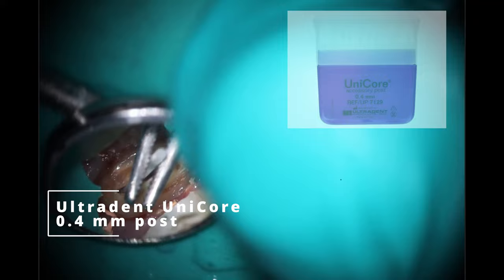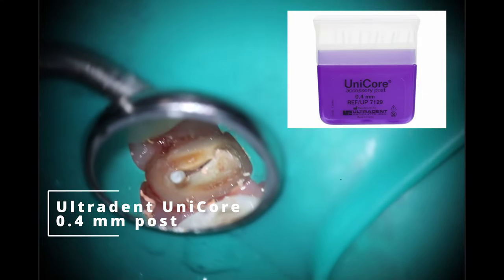This one was so tight I decided to use the accessory posts from Ultradent — they're 0.4 instead of 0.5. That tenth of a millimeter doesn't seem like much, but it makes a huge difference. They also look a little more radiopaque on the image. I noticed my angle was off and decided it's better to have more straight-line direction, because that's where you want the post to do its work. The reason we put posts in is not to retain the core but to help prevent snap-off failures. I want the direction of the post in line with the long axis of the tooth. Removing that tiny notch makes the posts more parallel and where they should be.